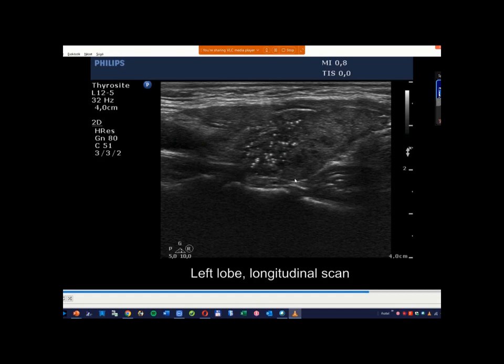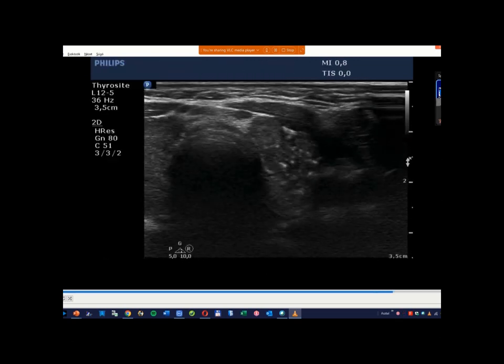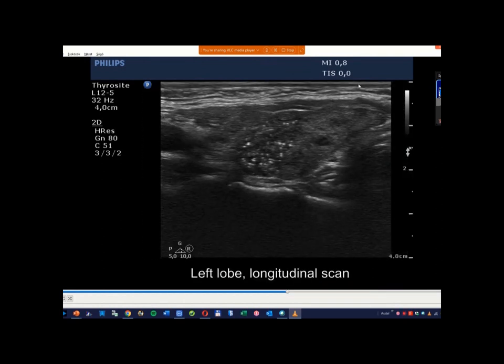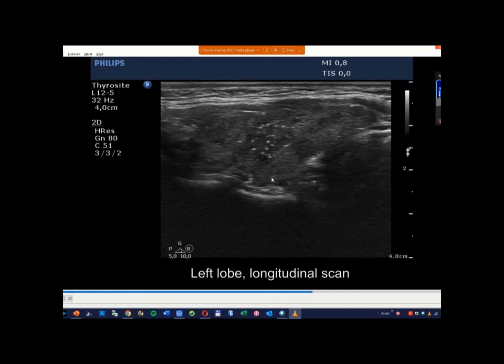So this illustrates not a particularly difficult case, but again, be aware: you read in the ultrasound report that the nodule has microcalcifications. You are faced with 3 times negative cytology. Compare this situation to that if you not only read, but also see this pattern. So I guess that you will be much more convinced of what to do if you personally see this ultrasound pattern and not only read about it.